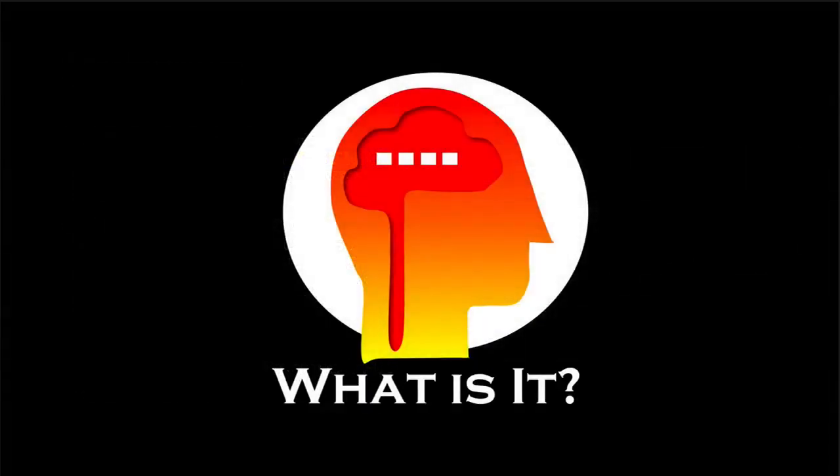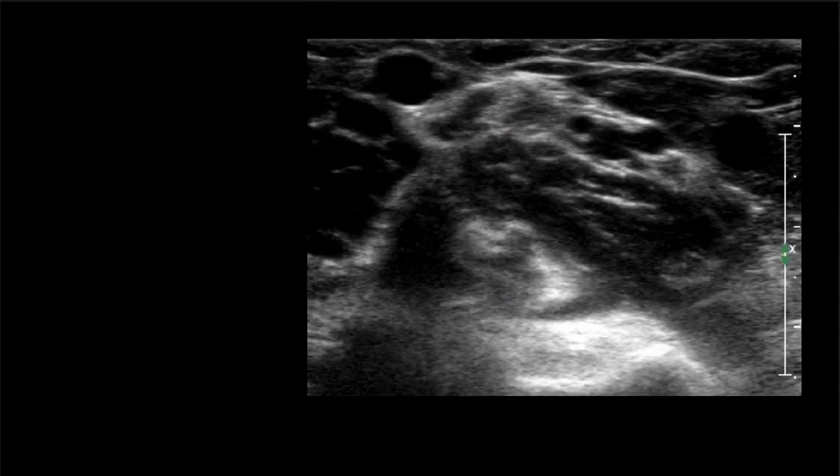Okay. Next case. All right, this is an anatomy case. Just to orient you here, we're in the upper arm, and we are looking, let's say we're putting a PICC line in, and they could ask you, what's that? What's that? What's that? What's that? So we're going to run through it real fast here. This one that's more medial and sort of up by itself is the basilic vein. These two flanking, Mickey Mouse kind of looking things are your two smaller brachial veins next to the brachial artery. That's how to remember that, because they have the same name.